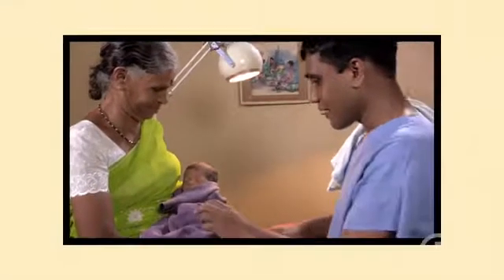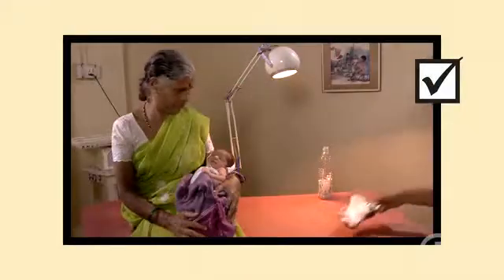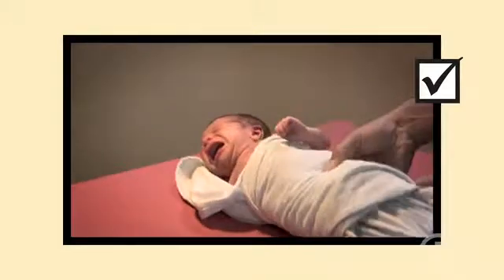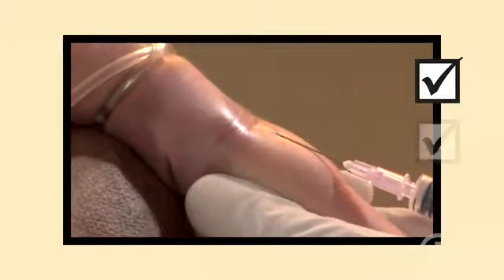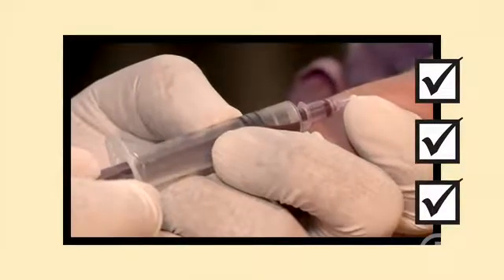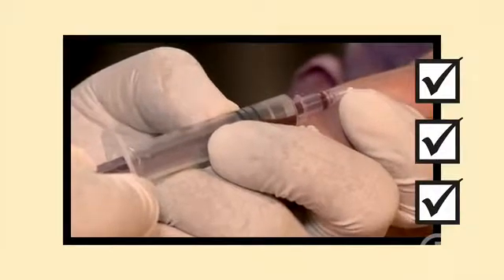Remember, before you start, inform the caregiver, gather all your supplies, and wrap the baby snugly. Take a shallow approach with the needle. Be patient with the baby's tiny veins. A slight pull on a syringe brings the blood.